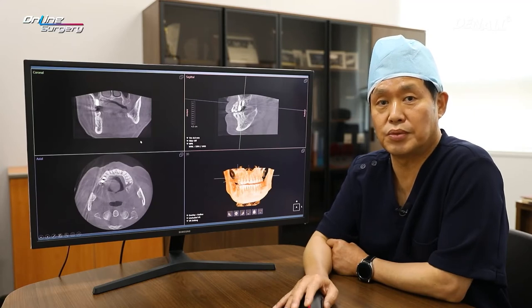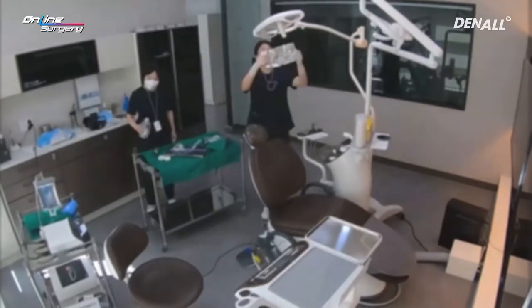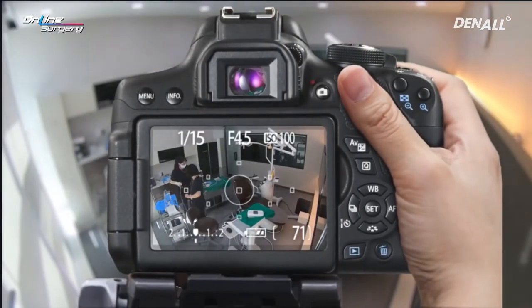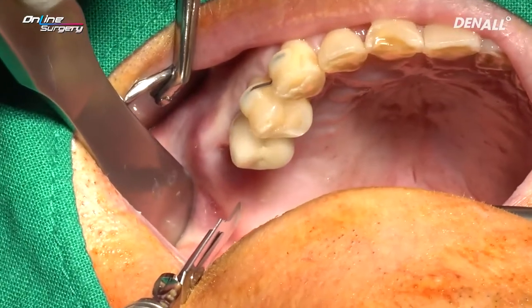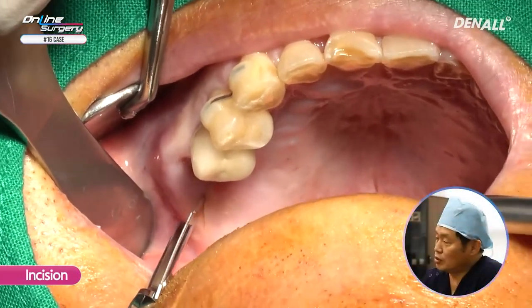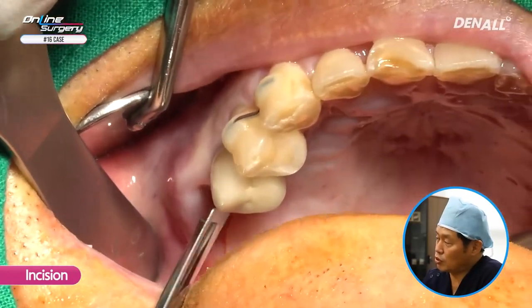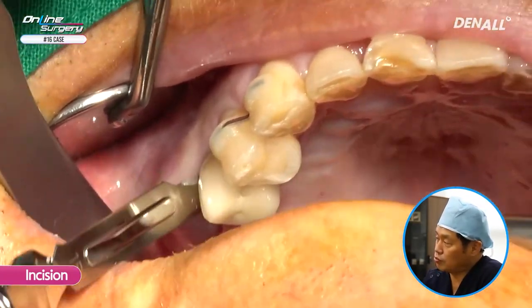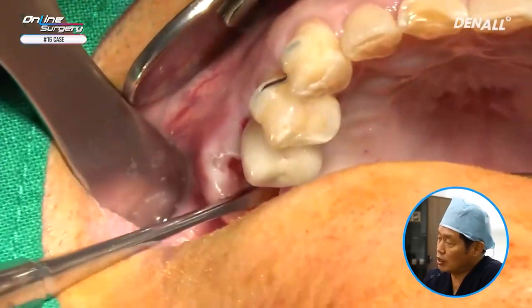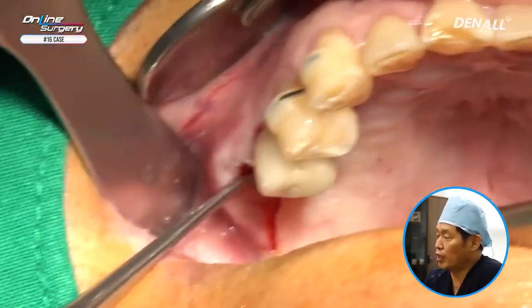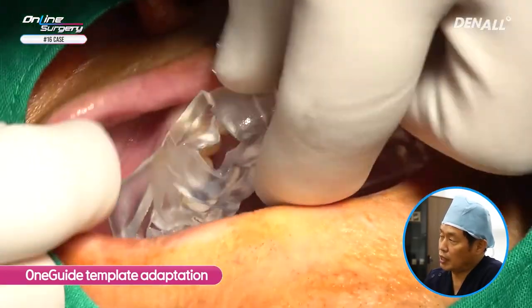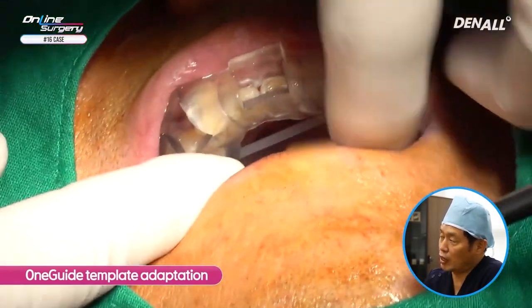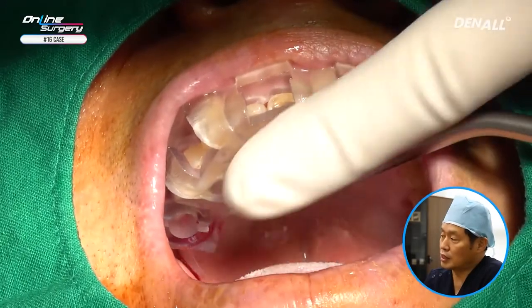Let's look at the surgery. Incision is being done. It is made from the distal side, almost as if you are pulling it. The reason why we do incision instead of a tissue punch is because this patient has an insufficient amount of attached gingiva. So a small incision is made, the flap is reflected, and the template is connected.